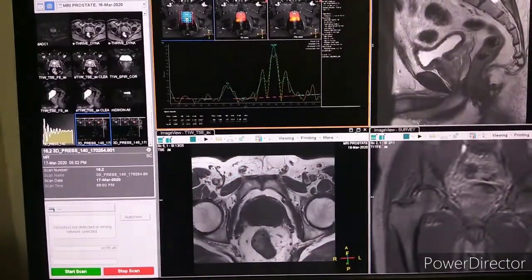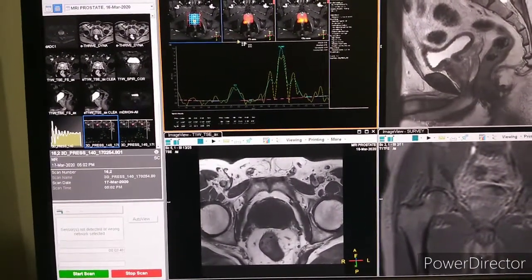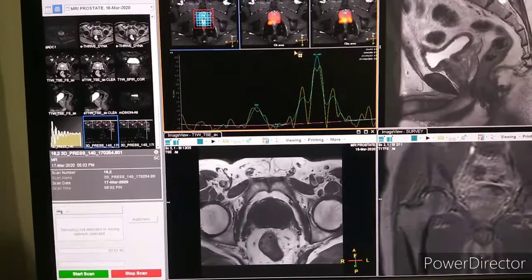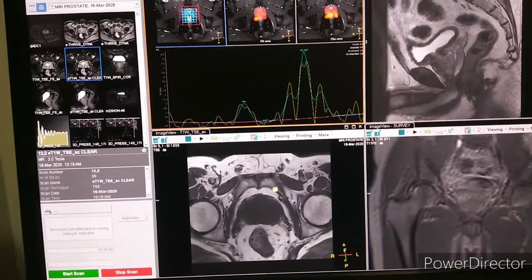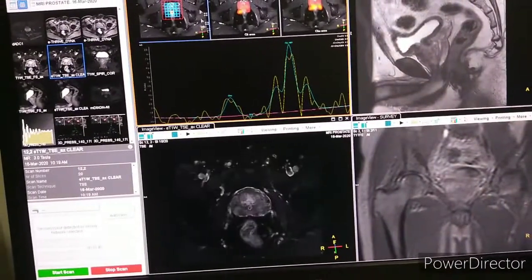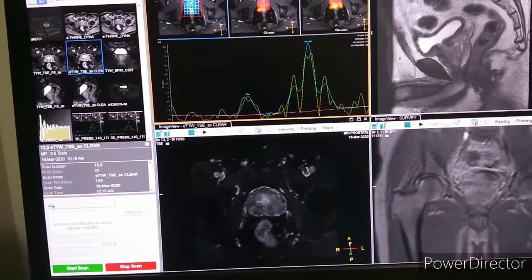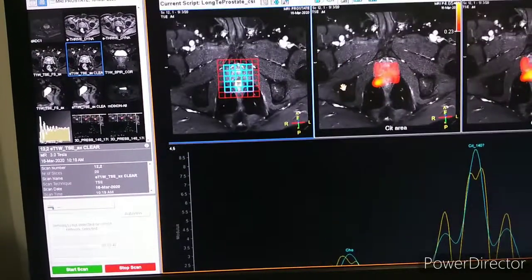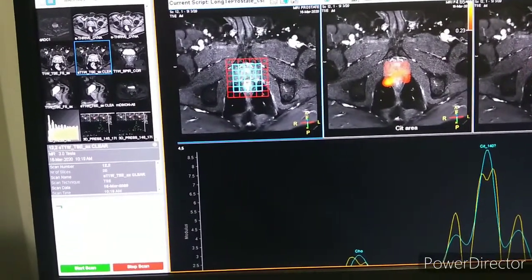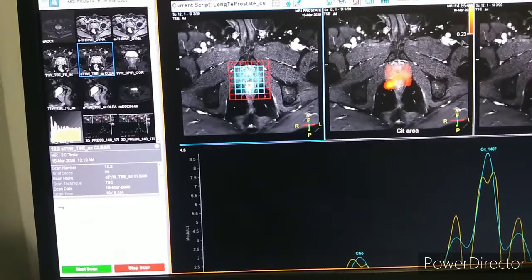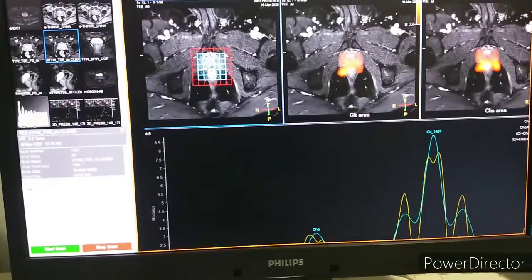And now the prostate multi-parametric spectroscopy. According to the lesion, we have to plan the spectrum. You can see we have placed it on the prostate and covered the lesion. We will now show you the processing of it.